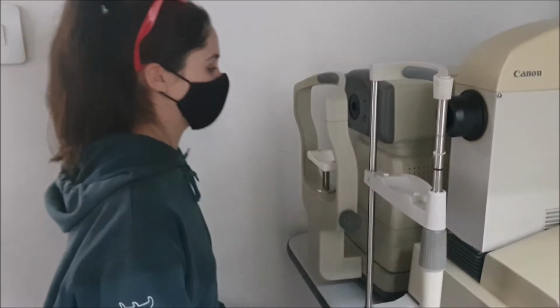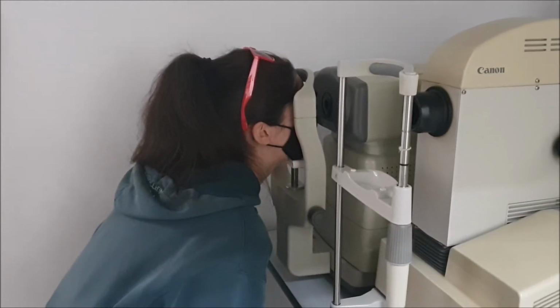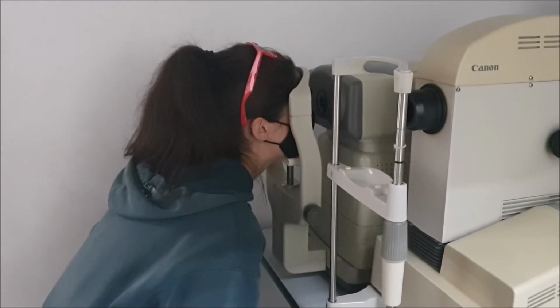The first machine she took me to was called an Autorefractor. And I'm sure you're familiar with this one. They had us do this in school, in primary school, they tested our vision with it as well. This is a little thing for you to put your chin on and a little thing for your forehead to go against to make sure your head is in the right place. And then you're going to look into the machine at a little picture. Usually it's either a picture of a little house down a long driveway, or it's a hot air balloon far in the distance.